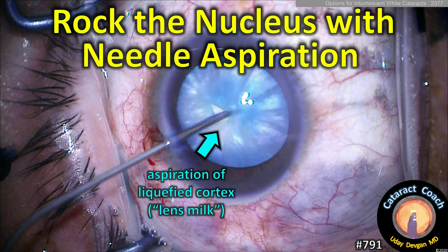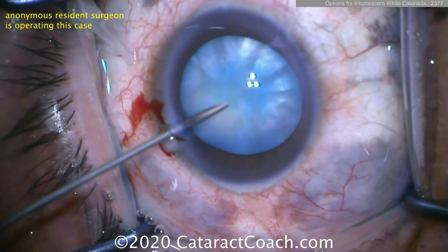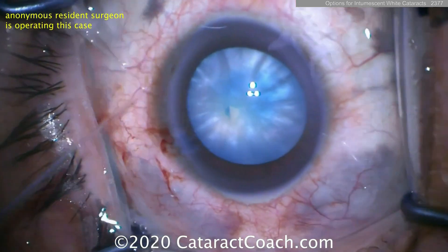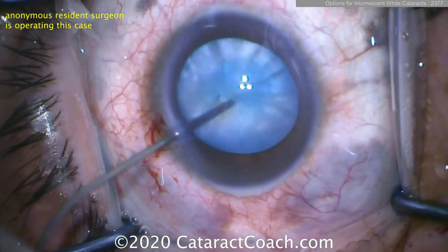So now what? You've got to recover. Here's why: if you do this you have to rock the nucleus. In the previous case it was zero nucleus grade — this case has a nucleus, and it has cortex surrounding the nucleus in all directions that's liquefied. So we aspirate a little bit here.